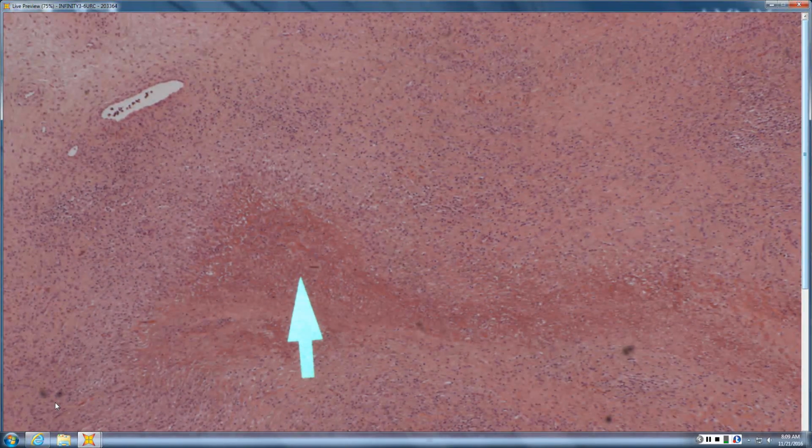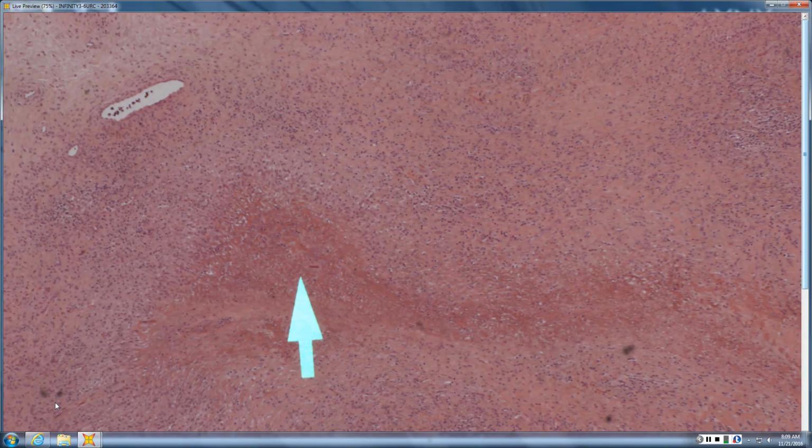I wasn't sure, but then I was thinking about it after, and maybe a rheumatoid nodule. So rheumatoid nodule, which is what this typically would be, and then the other thing that mimics a rheumatoid nodule and looks just like it is a pseudo-rheumatoid nodule, and the other name for that is? Anyone want to jump in?